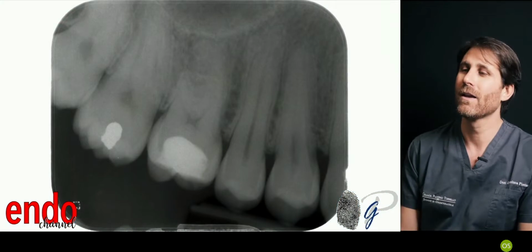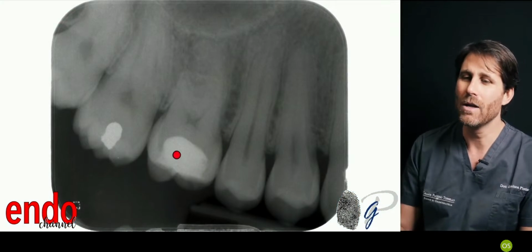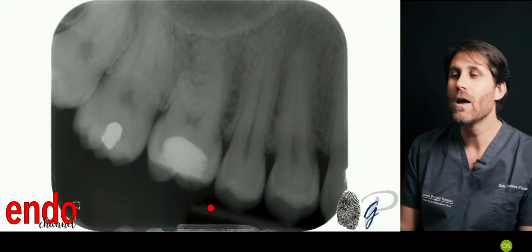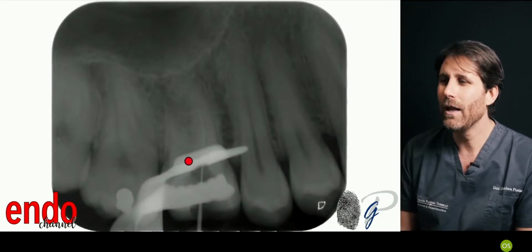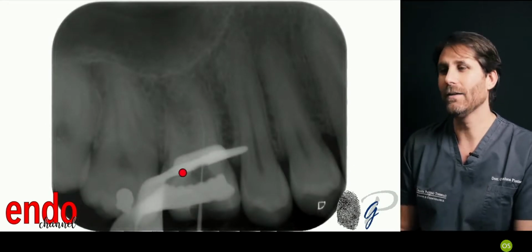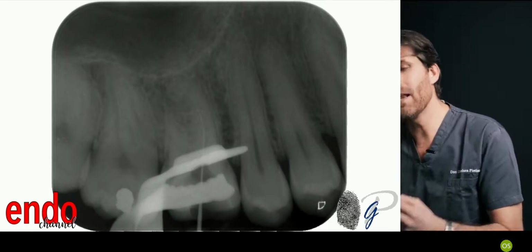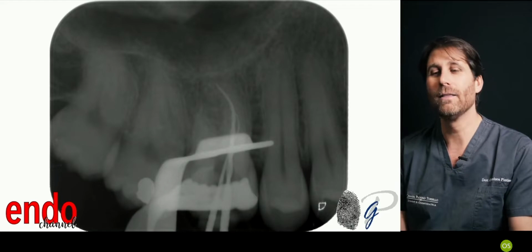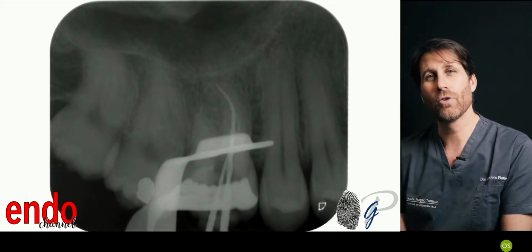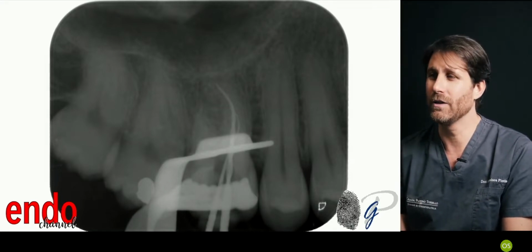And this is the radiographic example. A very big coronal filling. We remove the coronal filling, and then we will be less aggressive on dentin, because the dentin is irreplaceable. The coronal restoration, we can do it again at the end of the treatment.